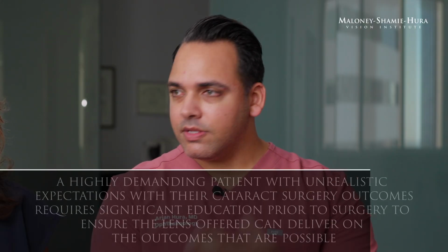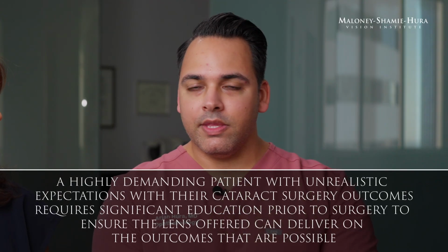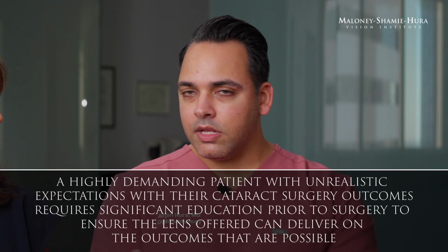And so when I look at a patient and I'm trying to assess what they would do best with, if I'm sensing that their expectations are really, really high, this is a patient who wants to be completely out of glasses, they want zero side effects, they want a guaranteed, "I want you to guarantee me 20/15, 20/20." These are patients maybe where the advanced lenses will not necessarily deliver because as good as they are, we know that there's no lens that's as good as the natural human crystalline lens we're born with. And so if their expectations are through the roof and through our counseling and through our discussion, if we can't either lower those expectations to a more realistic level, I think those are cases where maybe they would do better with a standard lens implant.